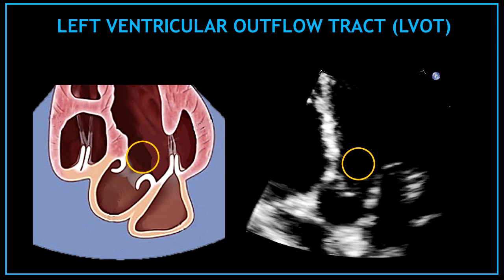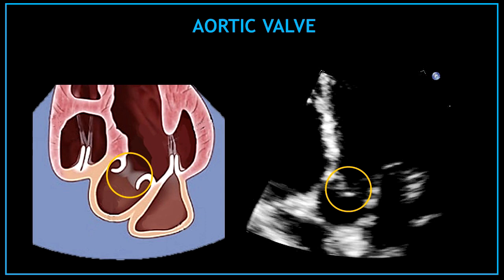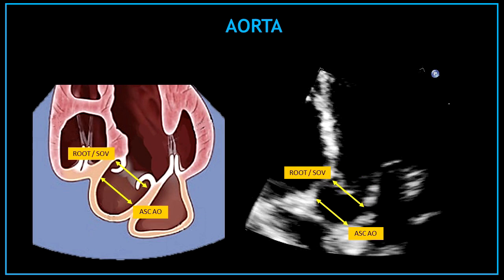The first new structure we can visualize in the apical 5 chamber view is the left ventricular outflow tract. The left ventricular outflow tract is this tiny space approximately up to 1 cm from the aortic valve annulus. One of the most important structures visualized in the apical 5 chamber view is the aortic valve. We can also visualize the aortic root or the sinus of Valsalva and part of the proximal ascending aorta.